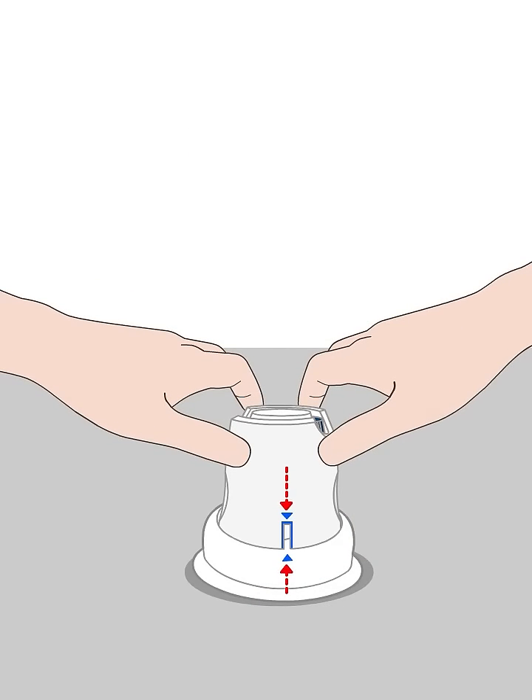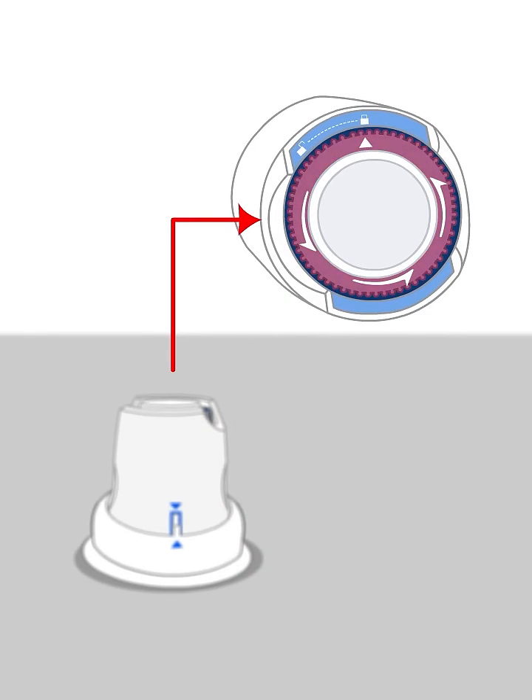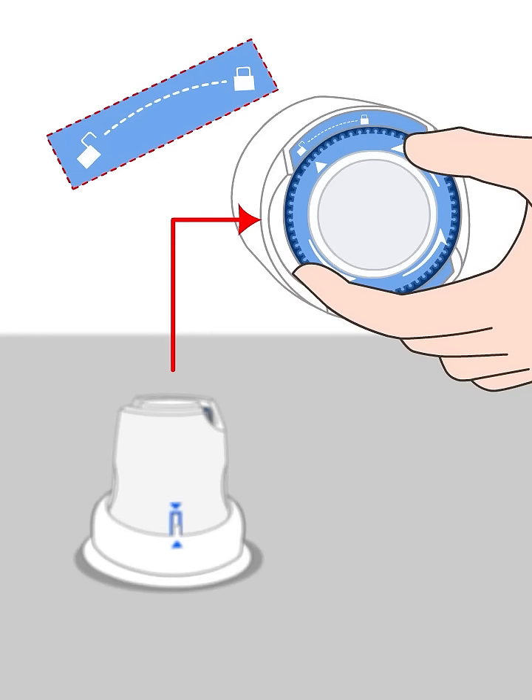Firmly press the white shell of the sensor applicator down into the tray until you hear a click and it comes to a stop. Then gently turn the safety switch from the locked icon to the unlocked icon until you hear a click and it cannot be turned further.